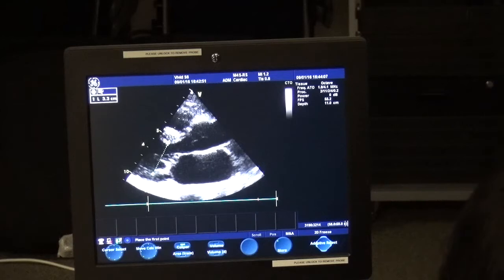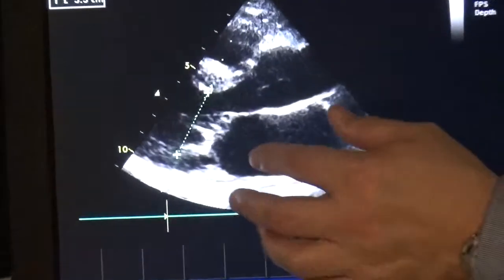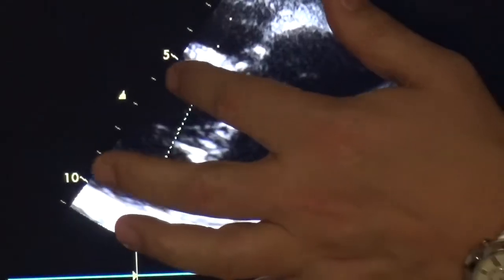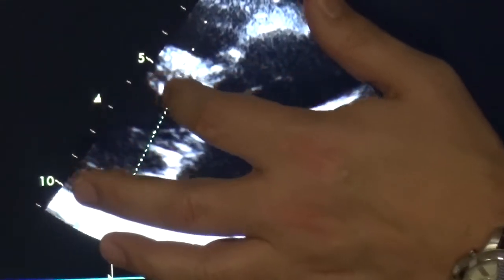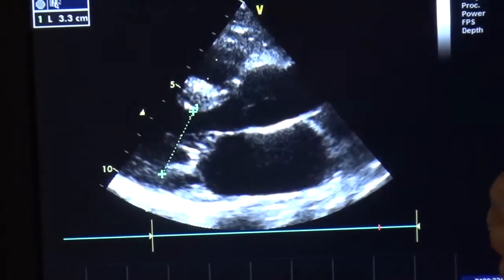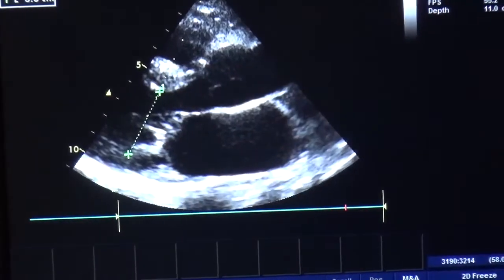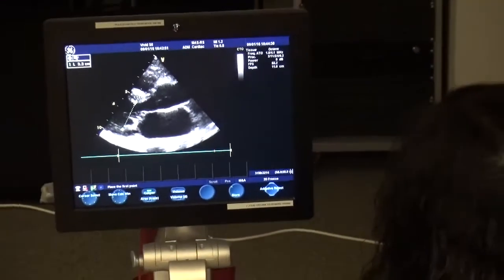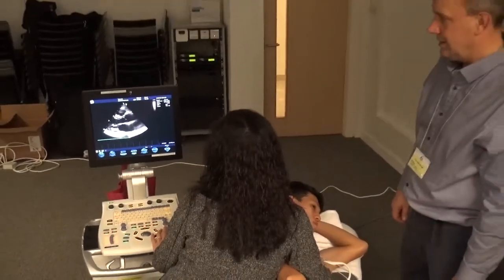Okay. And that's probably a little bit small, so we've maybe not quite got the end of diastole. It might be that the valve leaflets are still a little bit further apart. But can you see the band there? The wall thickness is there. We've got that extra band there. Now that might be a tendon or a trabeculation. In actuality, the wall edge is probably a little bit higher than that in terms of the image, but it's a good learning point. Okay? Well done, that's good. Okay, carry on. Okay, right, next group.